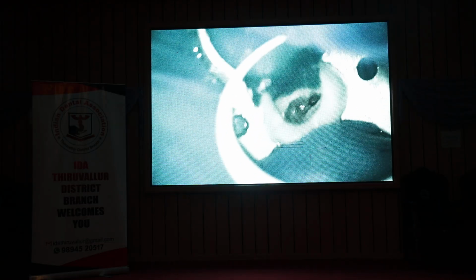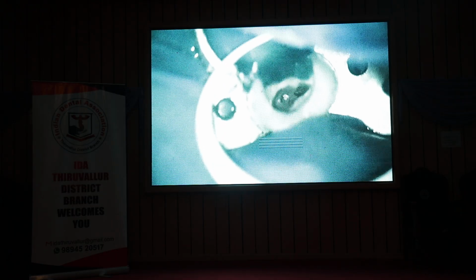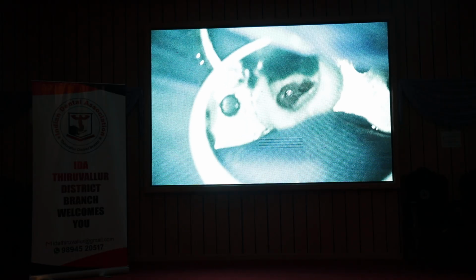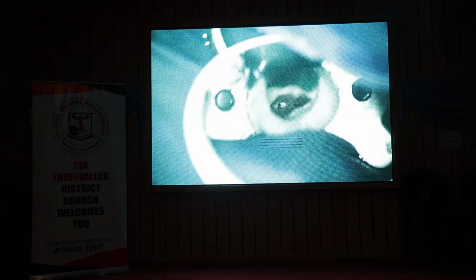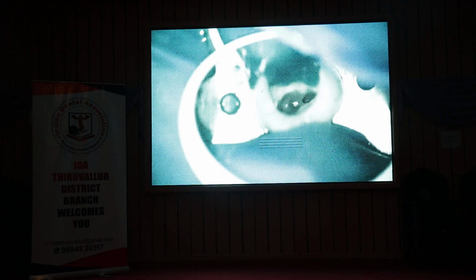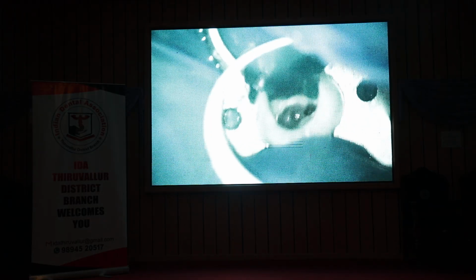Can you see, that's the buccal canal, the instrument is there. And you can see the palatal canal also there. So this is a merging canal. Failure to understand the anatomy has resulted in the instrument breaking. So I will remove that little bit of lipping of dentine. Probably you will see it in the next part.